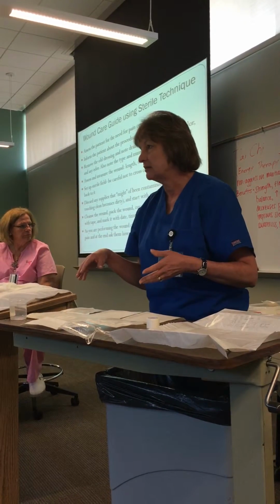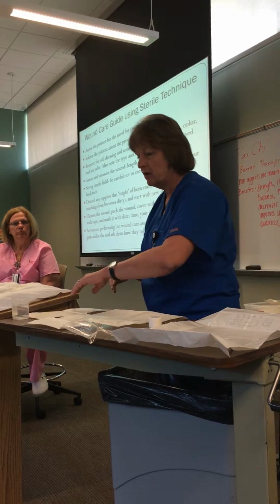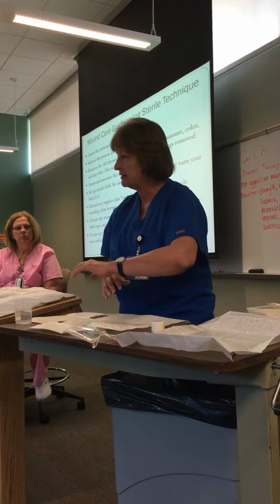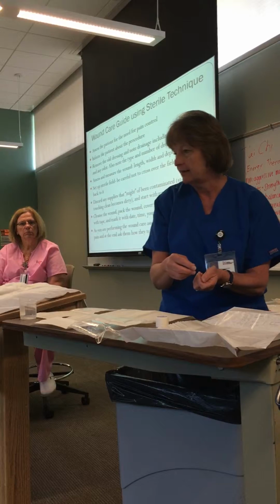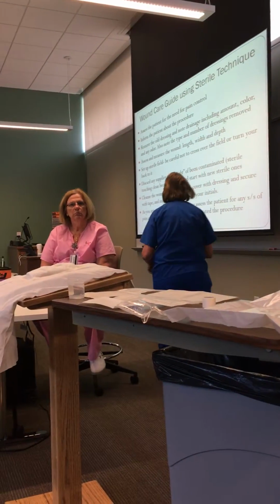And this takes practice, you guys. This takes practice. Because your natural tendency is to want to come and work like this while your other gauzes are here. So remember, you've got to kind of work to the side like that. All right, so let's pull up the documentation guidelines.